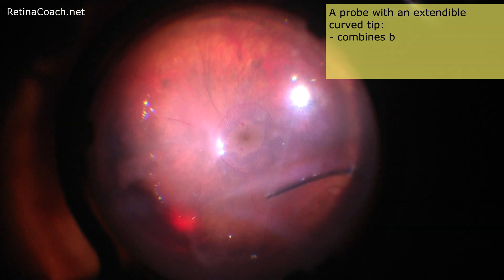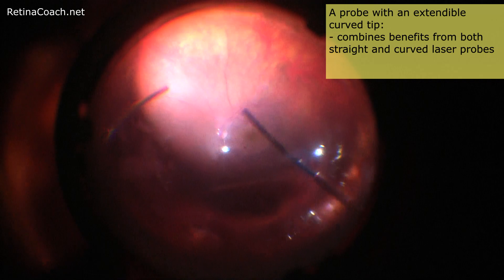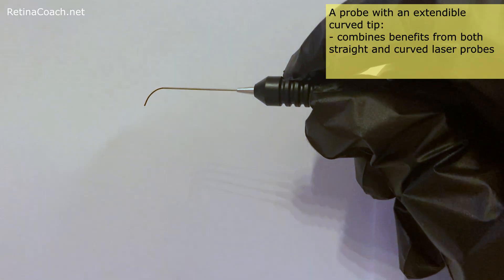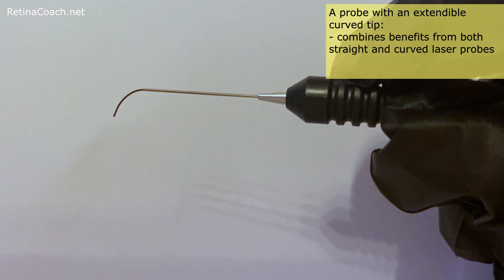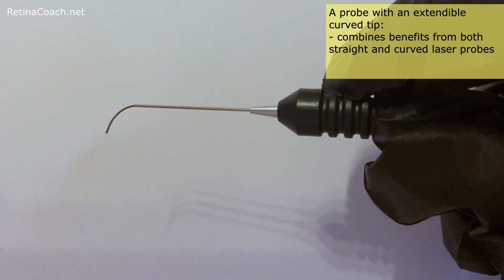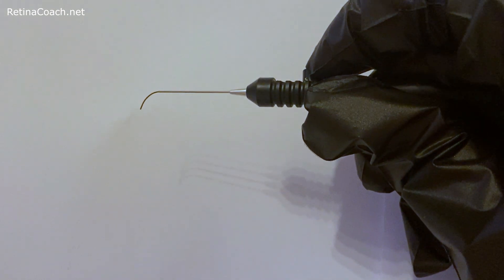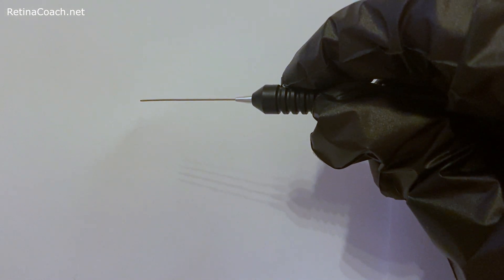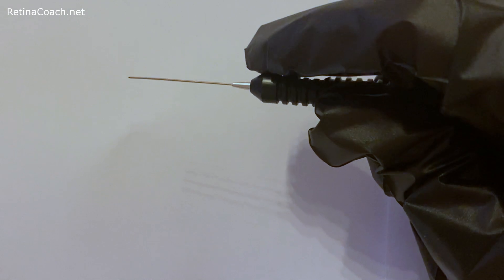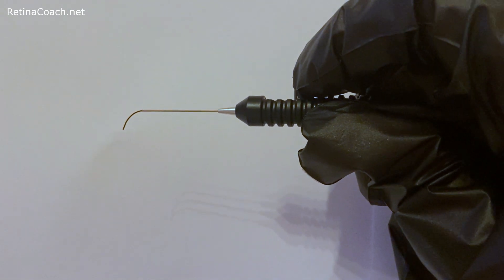There is also a probe with an extendable curved tip, which combines the benefits of both straight and curved laser probes. By releasing the handle, the probe returns to a straight position and can be safely inserted and removed. On the other hand, the extendable curved tip allows laser treatment even in the far periphery.